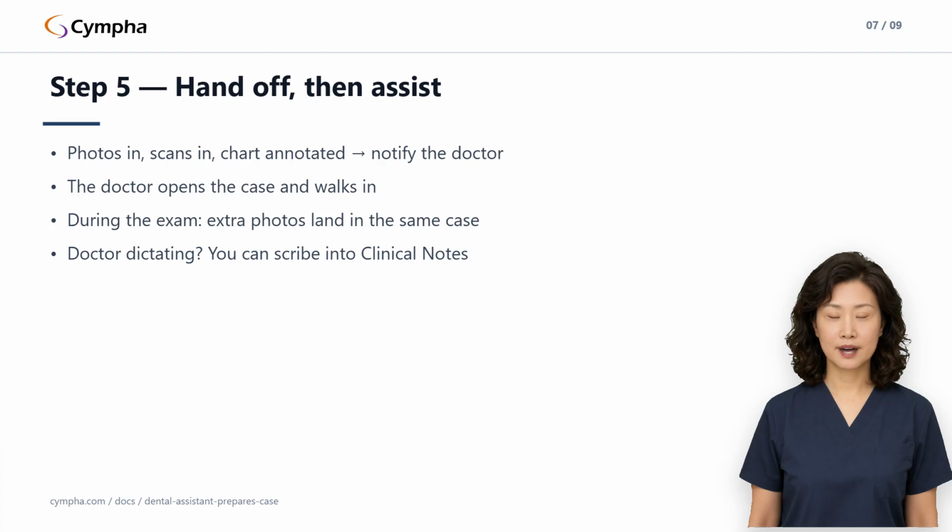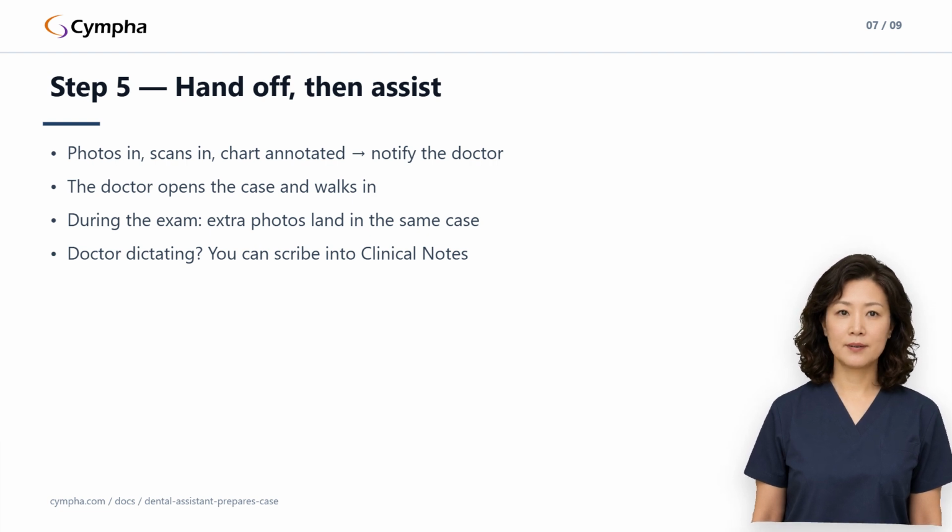And your role doesn't end at the door. During the exam, you keep working alongside, hand instruments, and when the doctor requests additional photos, run upload by phone again. The extras land in the same case in real time. If the doctor dictates into clinical notes, you can scribe, typing while they speak, so the findings are captured in the moment instead of reconstructed afterwards.